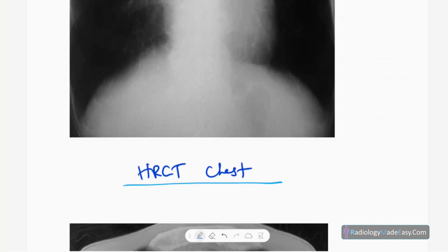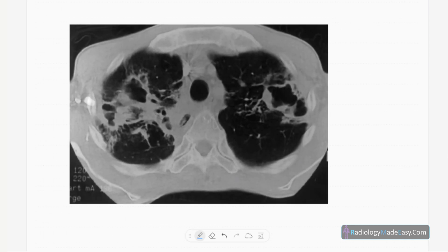On HRCT chest of the same patient, you can see fibrotic changes in both apical regions with dilated bronchi — a pattern of traction bronchiectasis.